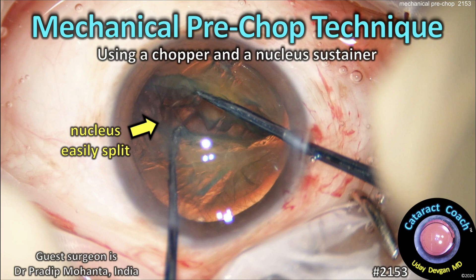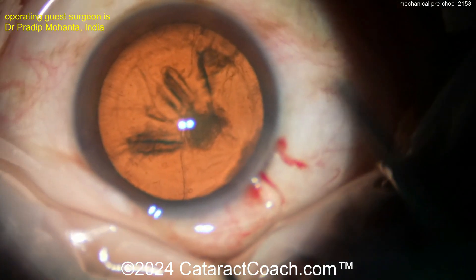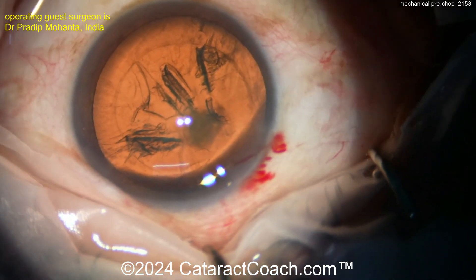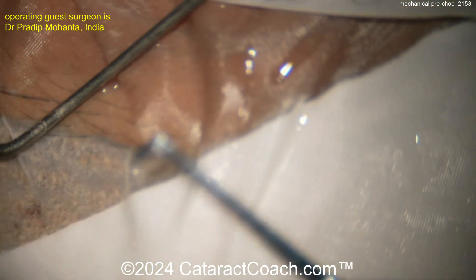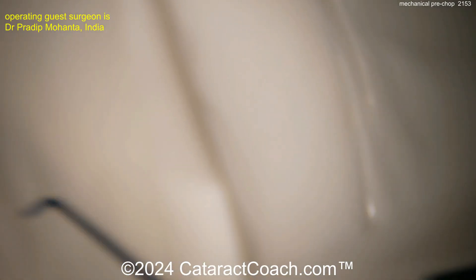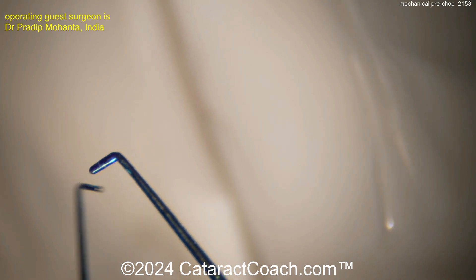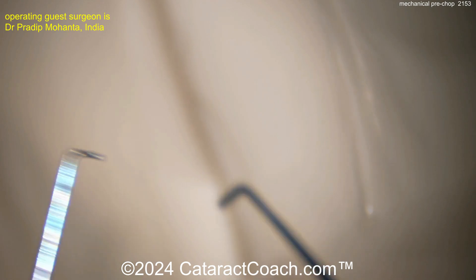From cataractcoach.com, this demonstrates the mechanical pre-chop technique using a chopper and a nucleus sustainer. The hydrodissection has already been done and there's a nice-looking capsulorhexis. A little viscoelastic goes in, then the two instruments: the chopper on the right hand and the nucleus sustainer — with a small ball tip — on the left hand. The goal is to trap the nucleus between these two instruments.